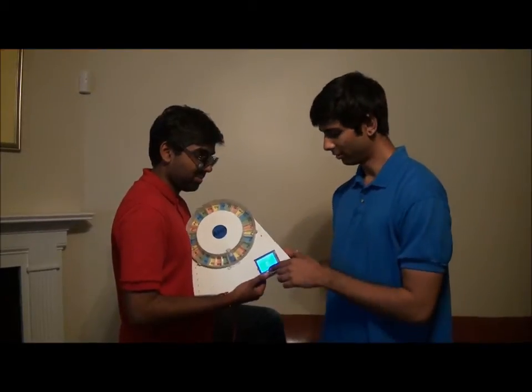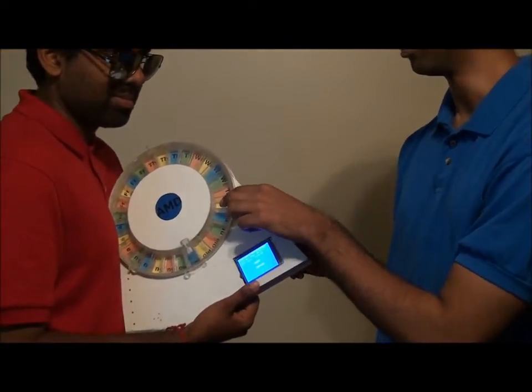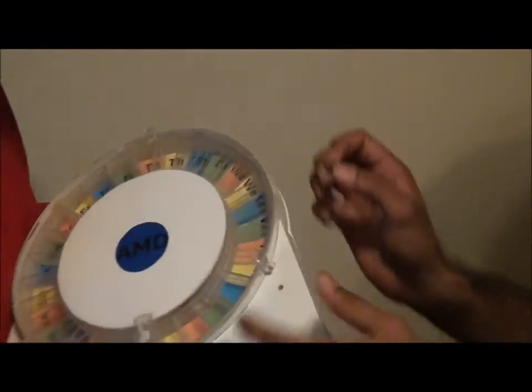Now I'm going to give you an overview of all the parts. Right here is the LCD touchscreen. Here is the medication drum. Here is the stepper motor turning the drum, and this is the housing.